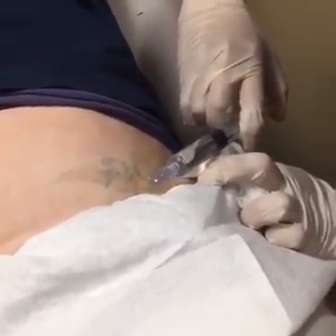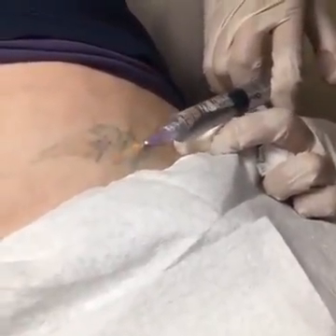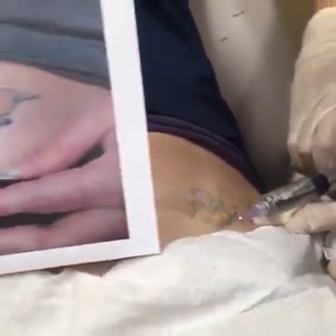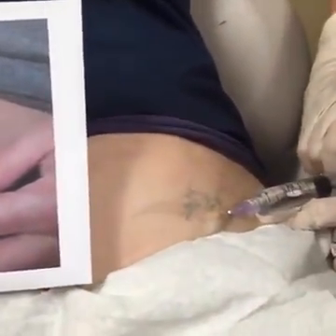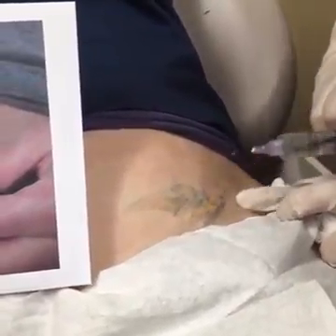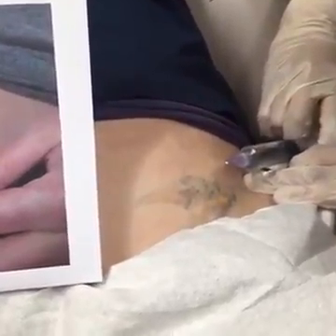So for laser tattoo removal, we usually recommend around 5 treatments for a tattoo. Give or take 2 treatments. It could be gone in 3. It may take 7. It's one of those things, every patient is different, so it's kind of as you go. Whenever the patient is happy with their results is when we're done.